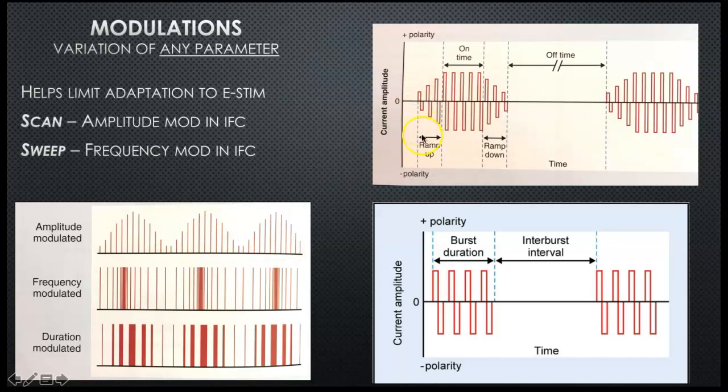Here's an example of what the ramp up time is. So the intensity is low and then it eventually gets high and then it's on and then it kind of phases down again.